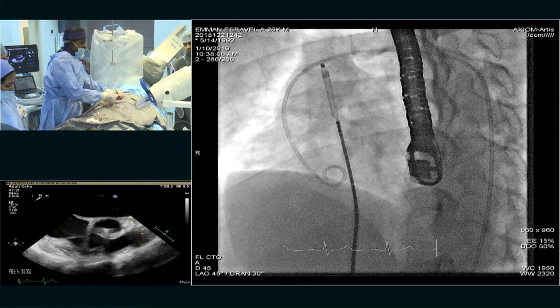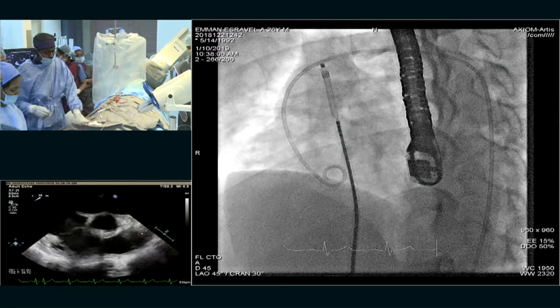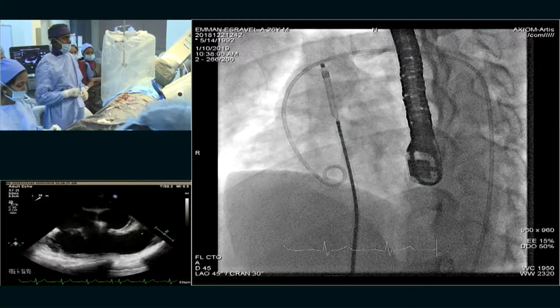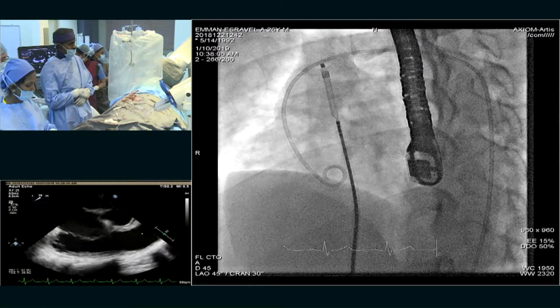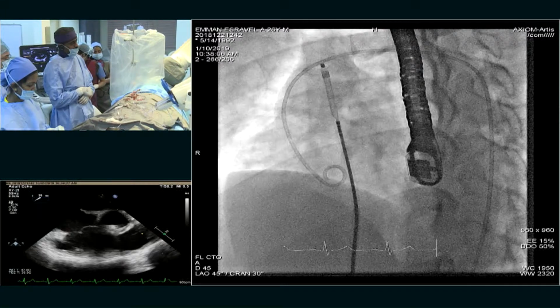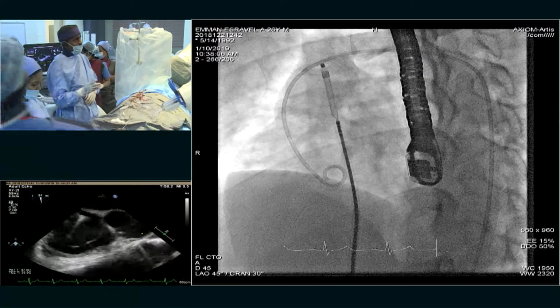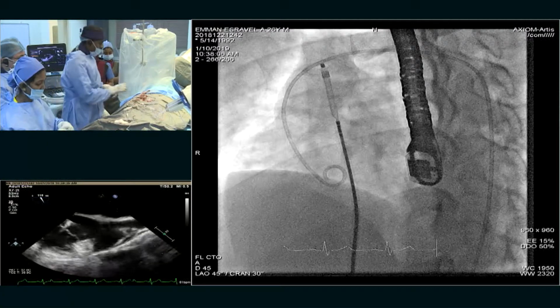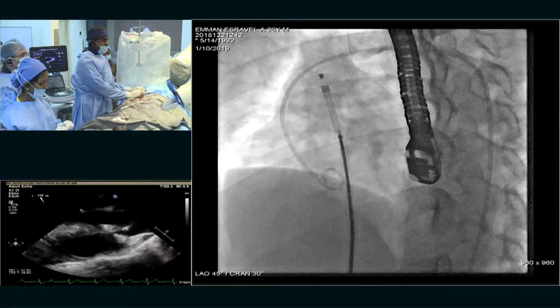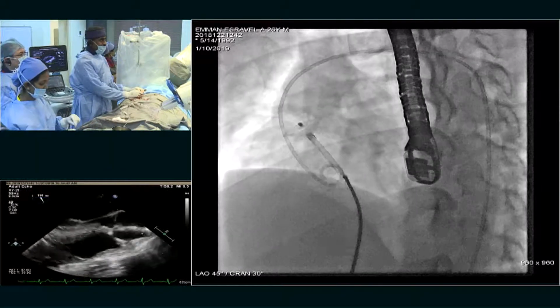Through the aortic valve, because this is a very soft device, Damien, I feel that it will possibly not cause a major problem for the aortic valve. In fact, there is a lot of literature, even a lot of operators' experience, about a regular ADO1 device that is brought through the aortic valve to form the aortic retention skirt like a ball and try to get it down. So I feel it is reasonably safer on the aortic valve.